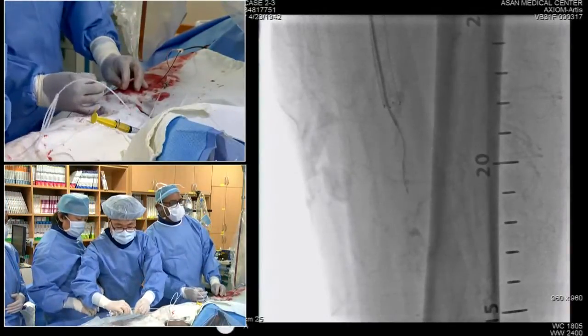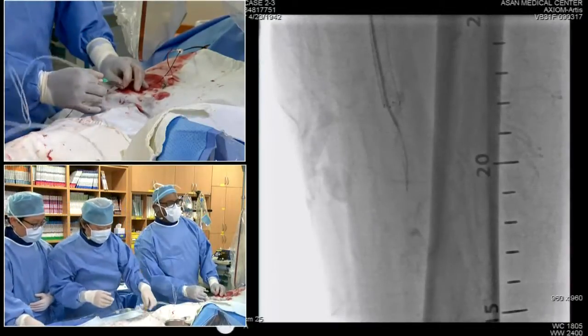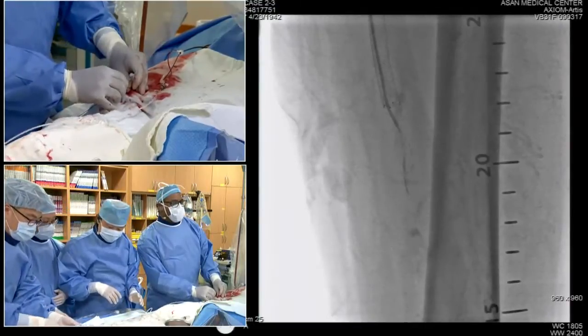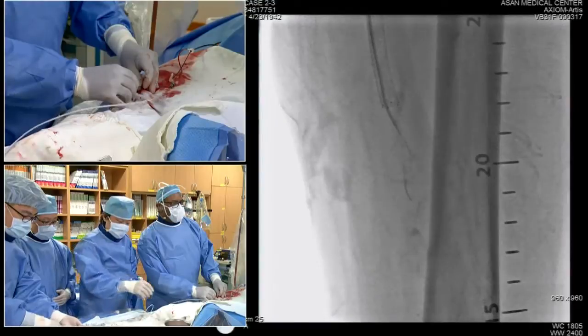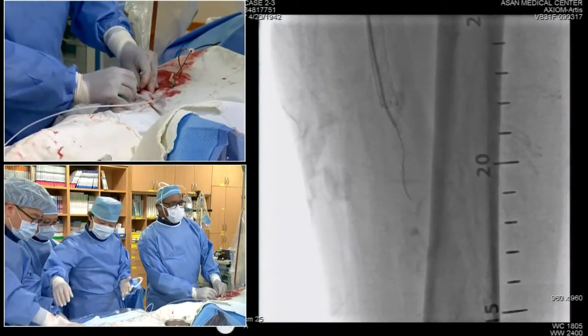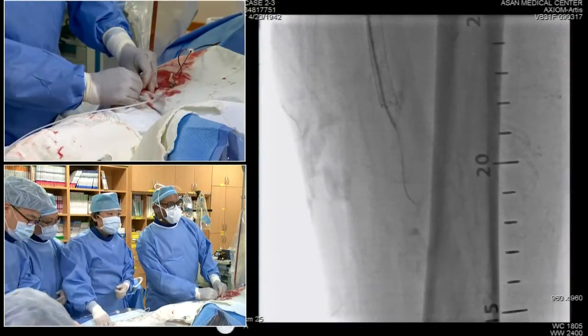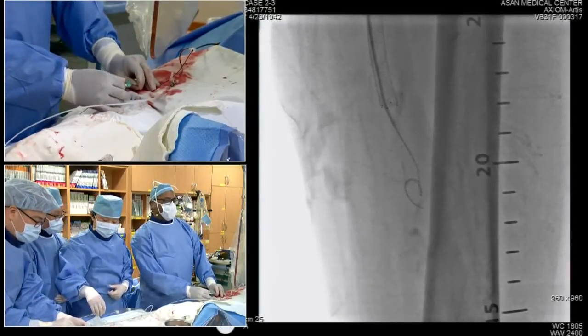So I guess the next question is, if he is successful in achieving a true lumen distally, what do you do with this vessel now? You have a long occluded stent. Balloon angioplasty alone is going to have restenosis rates probably in excess of 80%. What would you like to try here? Based on the Japanese data from Dr. Aida and his colleagues.